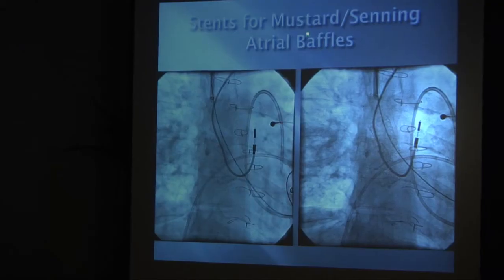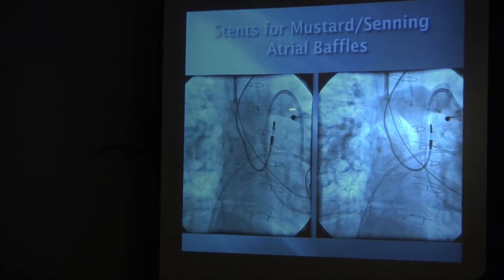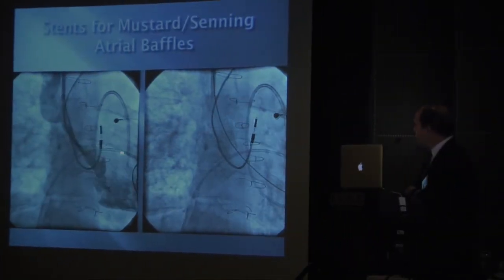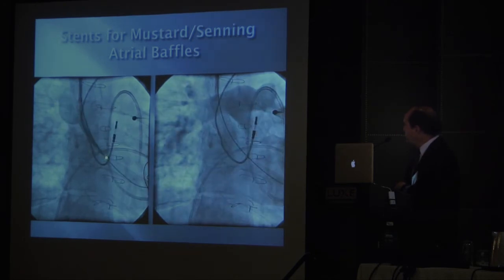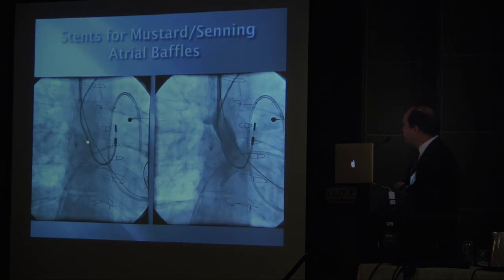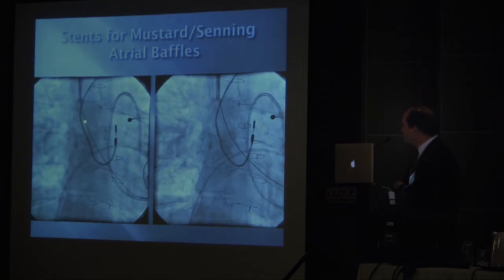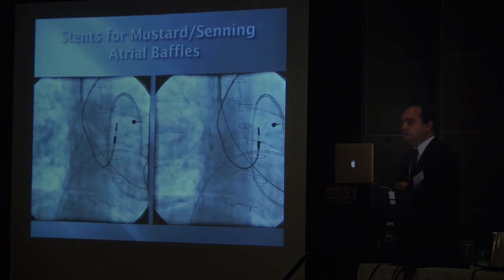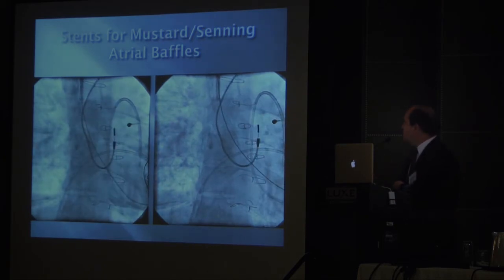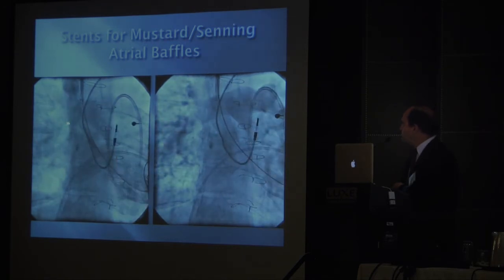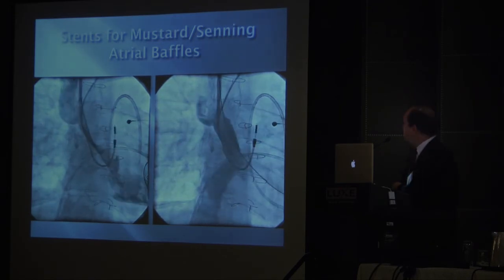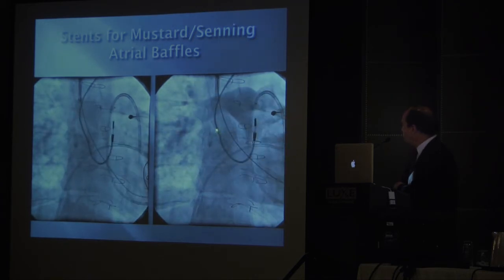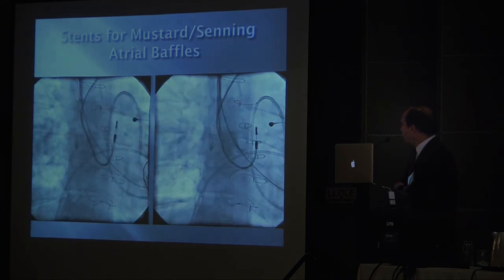This is an example of a patient with a Senning who has baffle obstruction. A stent has already been placed in the inferior vena cava to left atrium baffle. The patient has had heart block, has a pacemaker lead in, and now has a significant obstruction in the upper pathway — you can see that with this injection a lot of blood fills the azygous vein. The reason to maintain this open is that this will be the pathway for pacemaker leads in the future as well. Despite having a pacemaker lead in, a stent was placed — it does trap the lead in there, but allows further access to that area from that route.